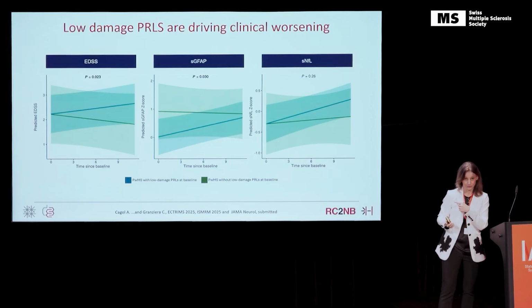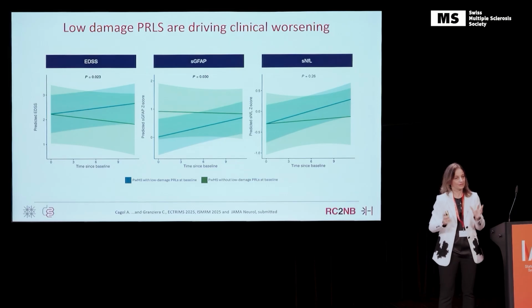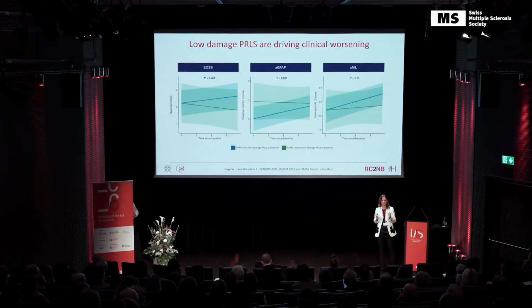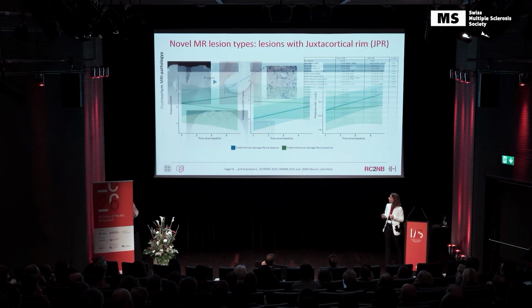What does it tell us? So this gave me a lot of hope, because in all these pharma boards, when they try to get as an outcome these PRLs, they're all puzzling. What do we take? More than 1, more than 2, the number? Or do we take the volume? None of them. What we need to look at is the microstructure, and these are the data that are supporting that. And perhaps, now we're looking at the extent of the iron rim in this low damage to see if there is a relationship to these broad rim lesions that were described.